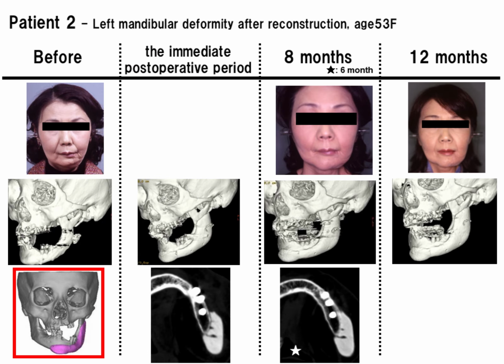Follow-up evaluations showed that the patient's facial appearance improved aesthetically without any serious adverse effects. CT scans taken at 6 and 12 months after surgery confirmed partial fusion between the CT bone and the host bone.